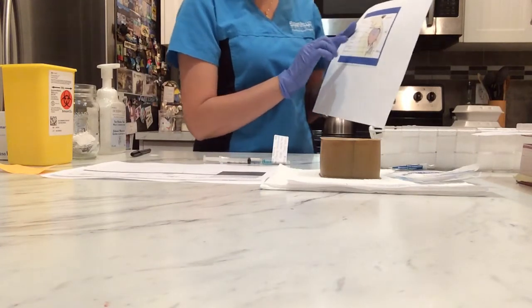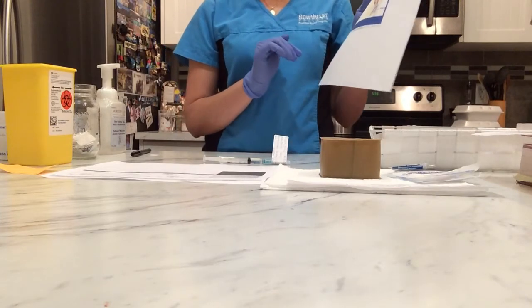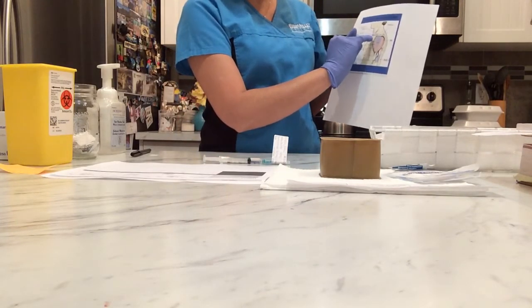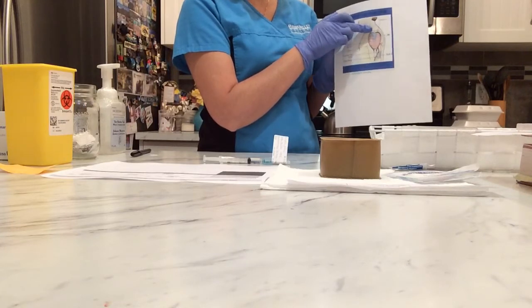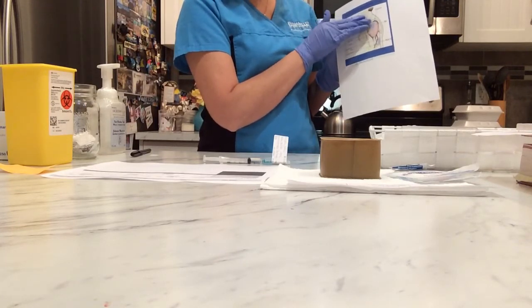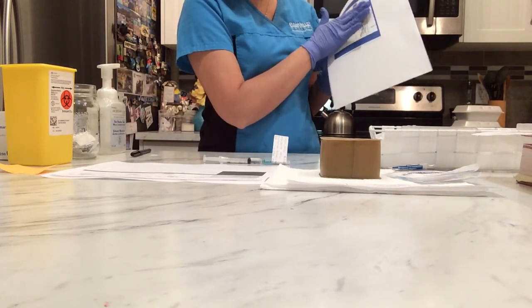So first I will choose the site, and I'm going to choose the right side of my patient. Then I will palpate the acromion process, the bony part here on top of the shoulder, and I will put 3 fingers down and make a kind of big V shape.